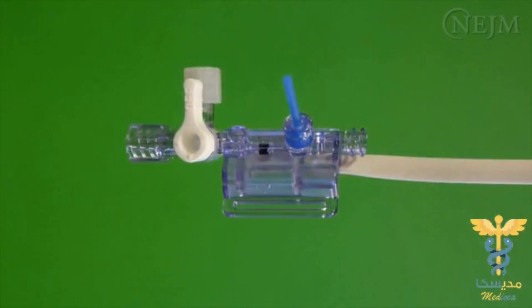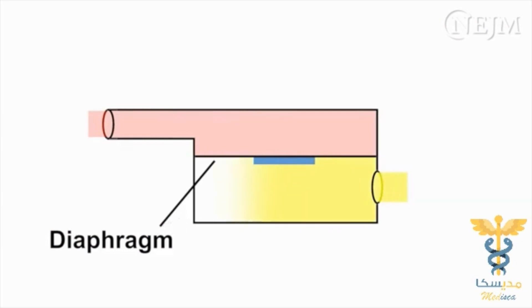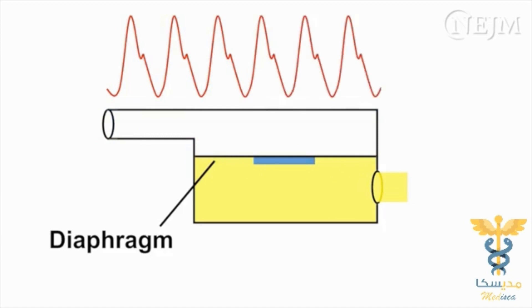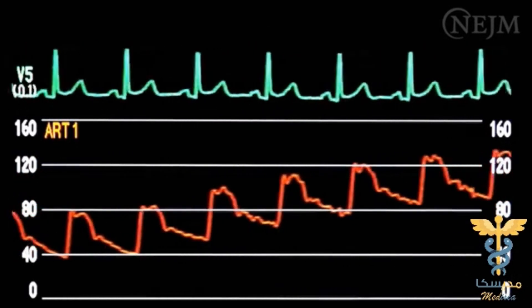This animation presents a simplified version of how pressure transducers work. The inside of the pressure transducer contains an impermeable silicon diaphragm. One side of the diaphragm is in contact with the fluid in the pressure tubing, and the other side is open to atmospheric pressure. The pressure of the fluid physically deforms the diaphragm. Through these small changes in shape, the diaphragm stretches or compresses strain gauges attached to it, consequently changing their electrical resistance. These changes in resistance are subjected to mathematical transformation within the monitoring software and displayed as a waveform.